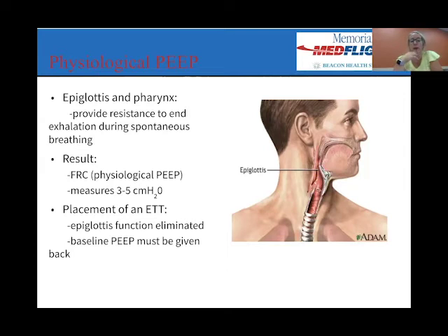In a normal healthy person, you will see in the adult world, I know for sure, that we're using higher PEEPs when we're trying to oxygenate people, especially with severe disease lungs, that maybe have a lot of secretions, whatever going on in their alveoli. They'll increase the PEEP, and we're even seeing PEEPs as high as 18 to 20. So don't be alarmed if you see a high PEEP, but just know that you've got to give them some PEEP to start with. You want those alveoli to be open and the oxygen exchange to happen there.